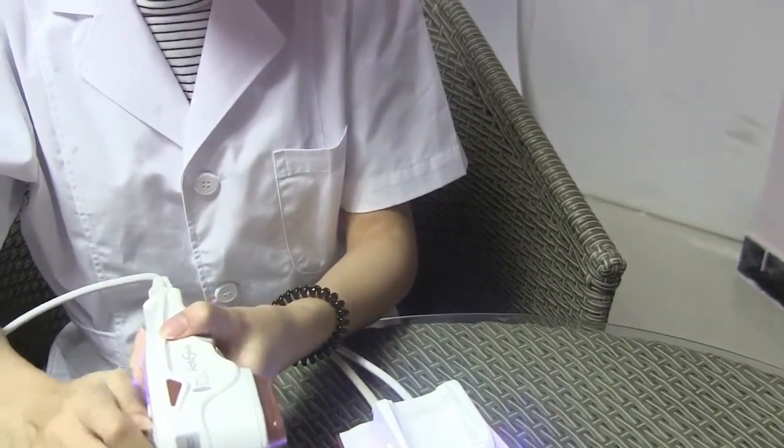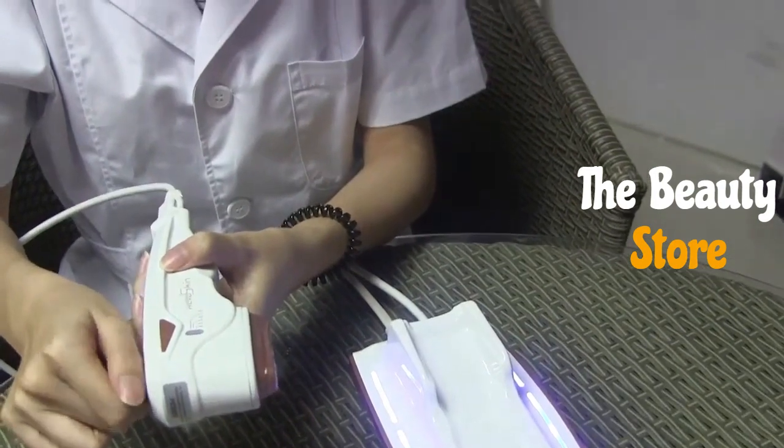And also the same way up to the eyebrow. And then we change it to 3.0. And also do it, repeat it. Firstly using the 4.5 and then using the 3.0, repeat horizontally and vertically. And remember, each shot you can move 1 millimeter.